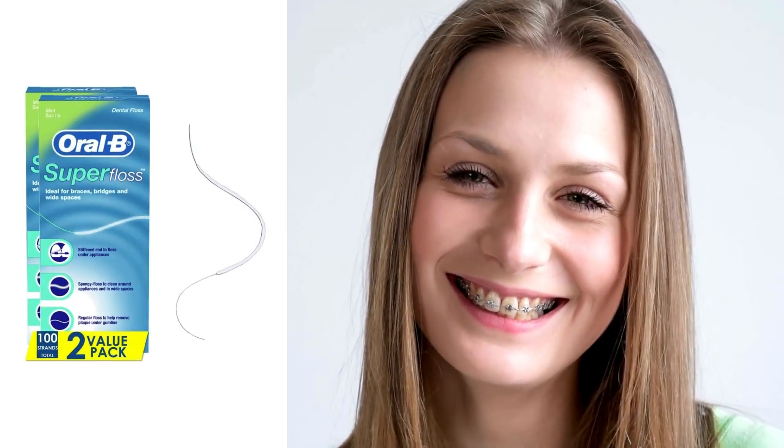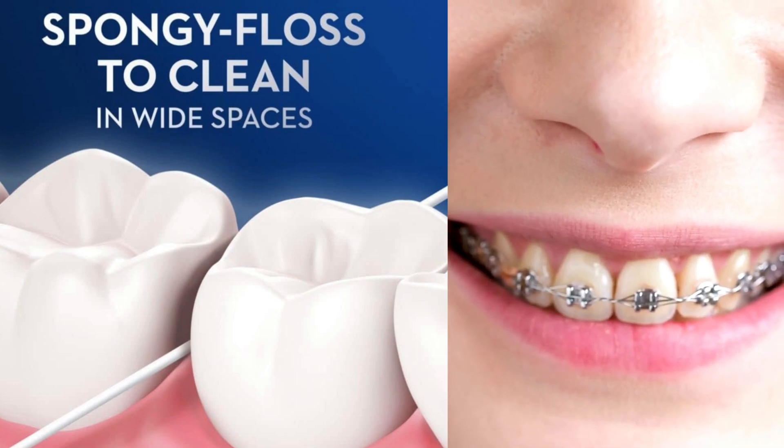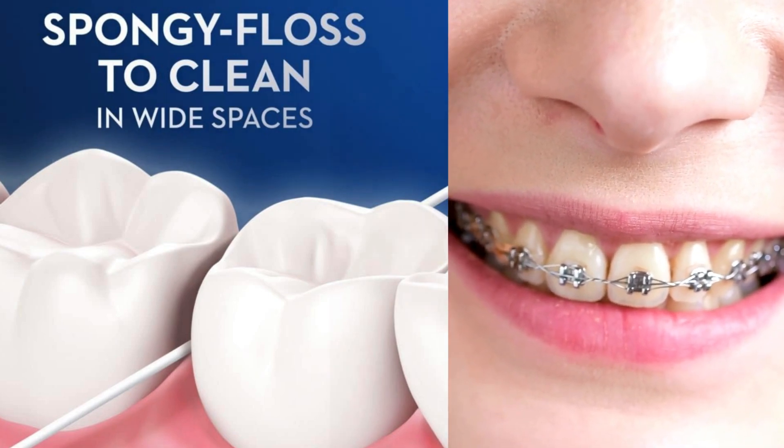The Oral-B Super Floss is a three-in-one solution for dental hygiene challenges posed by braces. The stiffened end is a game-changer — it works like a floss threader, making it a breeze to get under braces and appliances. After threading, the spongy part comes into play, perfect for cleaning around brackets and in wide spaces.